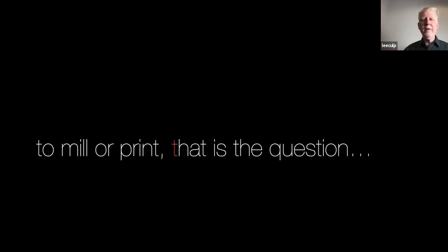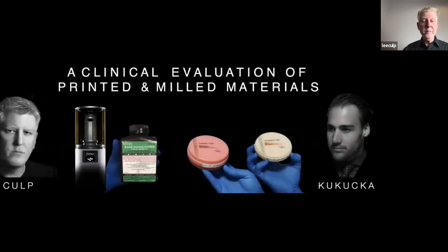So right now, for the lack of a better term, for the economy denture, printing is a wonderful option to serve that community. If you want the perfect denture, then we're going to be milling, and I don't know how much longer, because everything is getting better in printing every day. But final is we mill final dentures, we print try-ins.